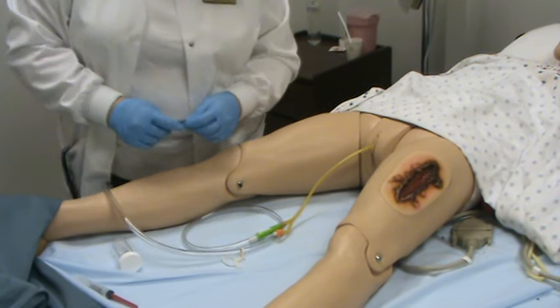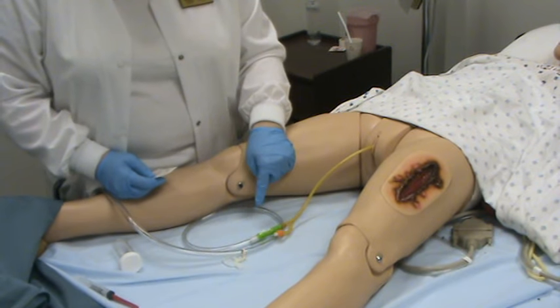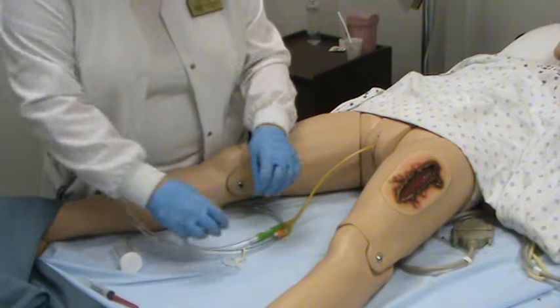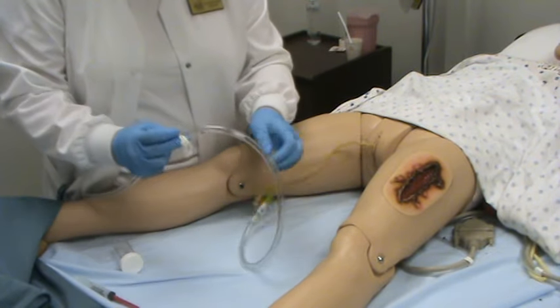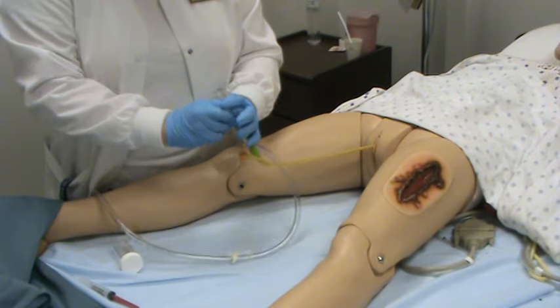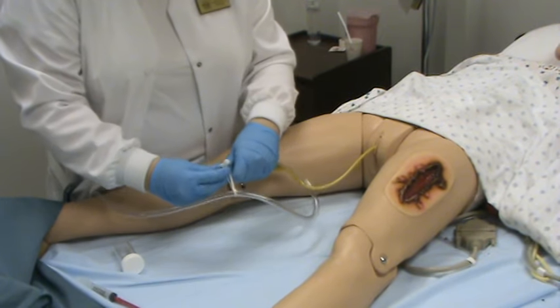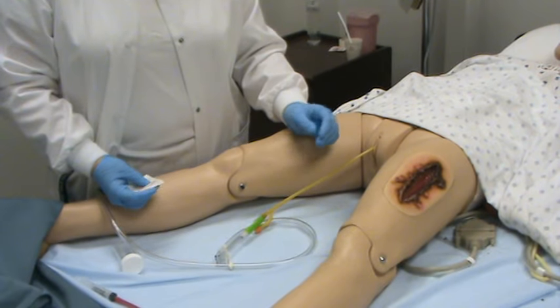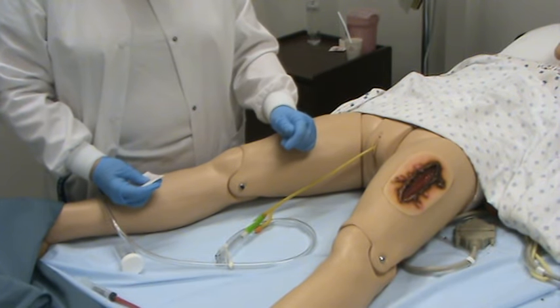For urinary specimen collection, if there is no visible urine in the tube, you will need to clamp the tube for at least 15 to 30 minutes. To clamp the tube, it's fairly simple — you can clamp it just below the port where you're going to be taking your specimen. Just bend it in half and put the clamp from the bed on it, and that should be enough so that the urine will back up into the tube.